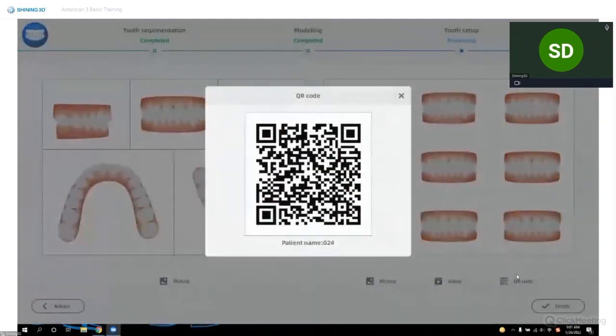So you can scan this QR code with the camera function from an iPhone. You can directly scan the QR code. It will give you a website that includes those pictures and videos. You can try it right now. I will leave the QR code here for some time.